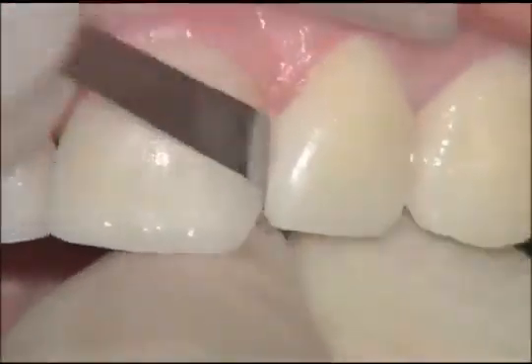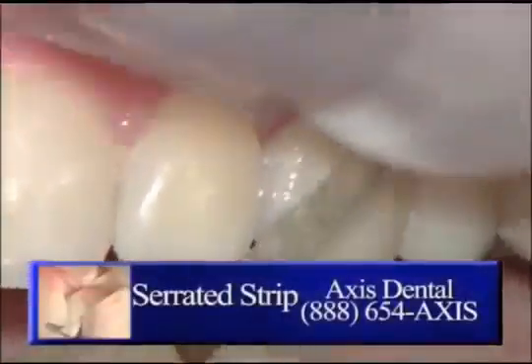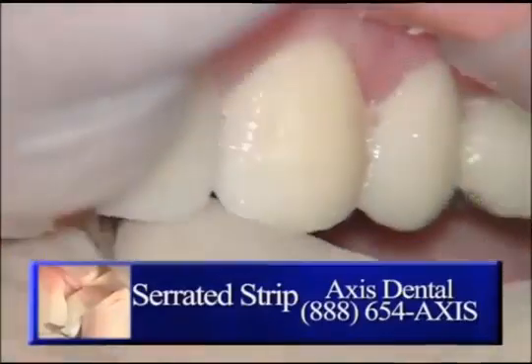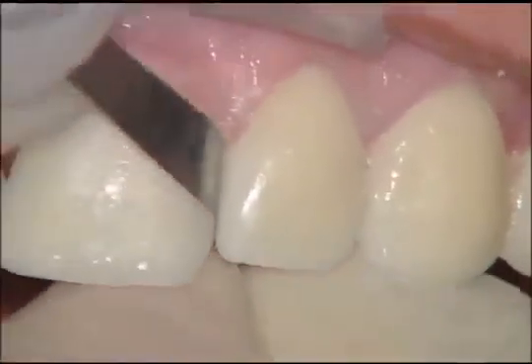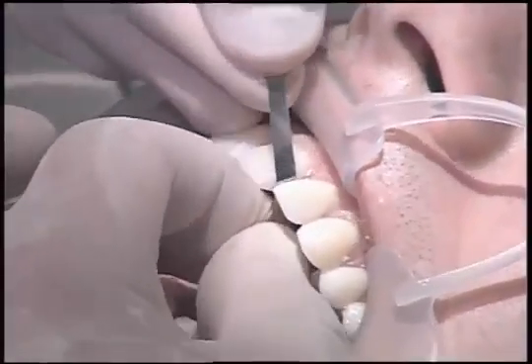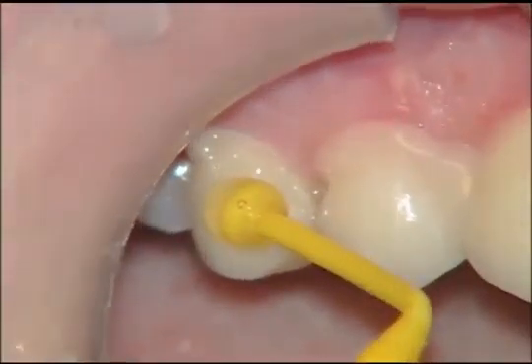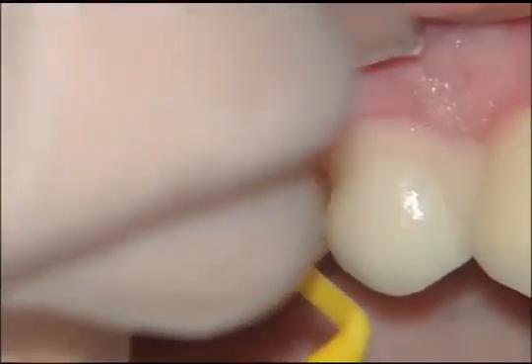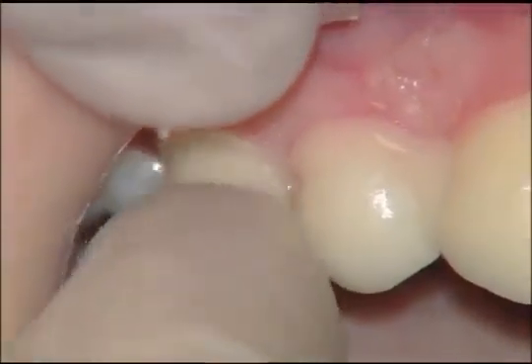If we can't get the floss through, which we weren't able to do between the central and the lateral, we are using a serrated strip from Axis Dental. This is a safe-sided strip that doesn't remove on the mesial and distal, but has serrations on it so that you can cut through any bonded resin, whether it's bonding agent or resin cement, that keeps the floss from going down. Of course, you do have to be careful when you're using this, working it back and forth so that you don't cut the gingiva. We're now placing the bicuspids into place, and again with these smaller veneers, it certainly is nice to be able to use the Viva sticks, and then I'm just going to hold on to the restoration with an Explorer while I pull the Viva stick off the restoration.